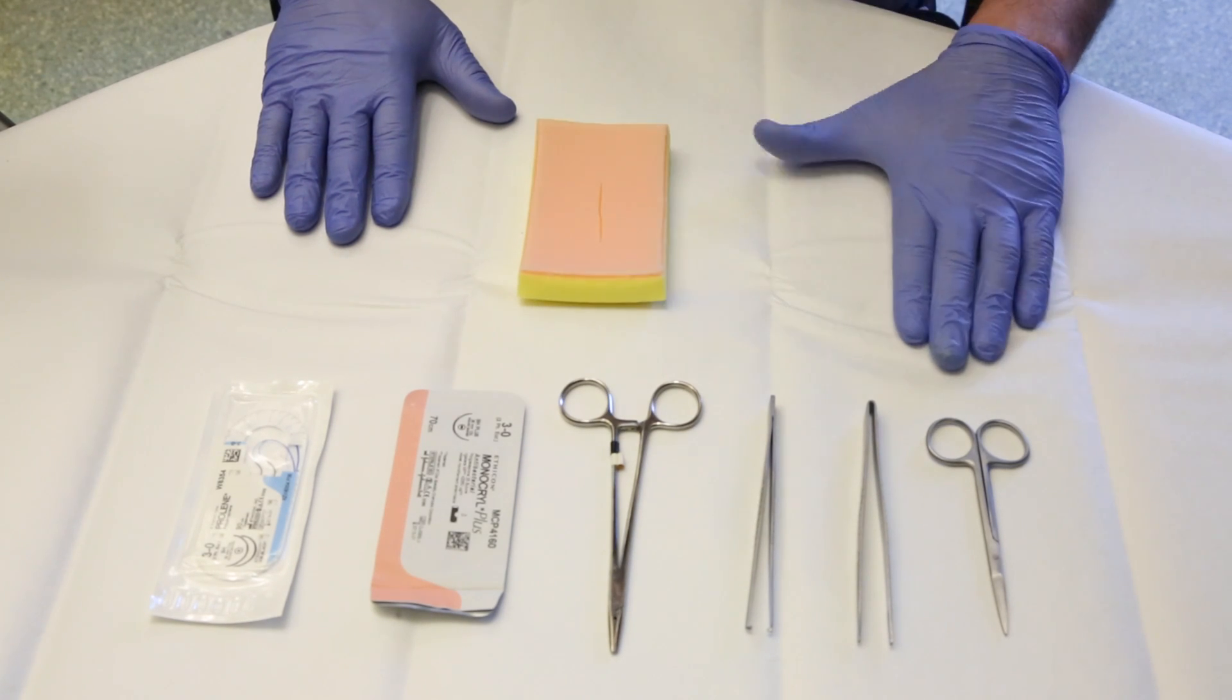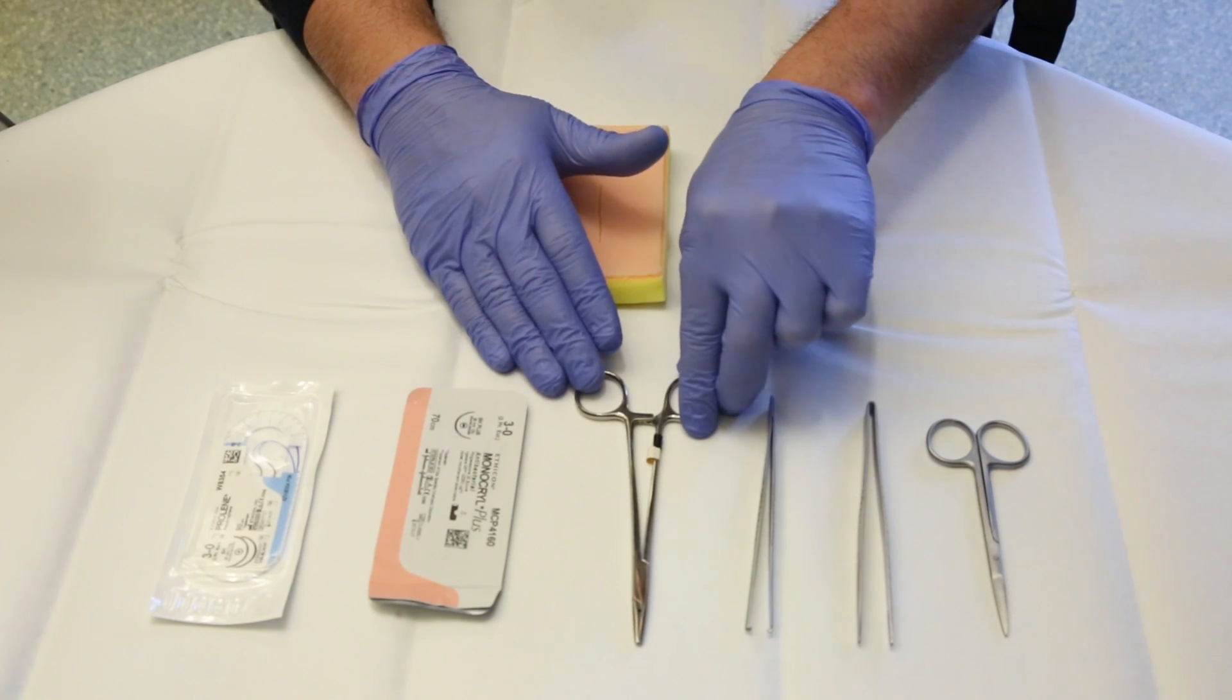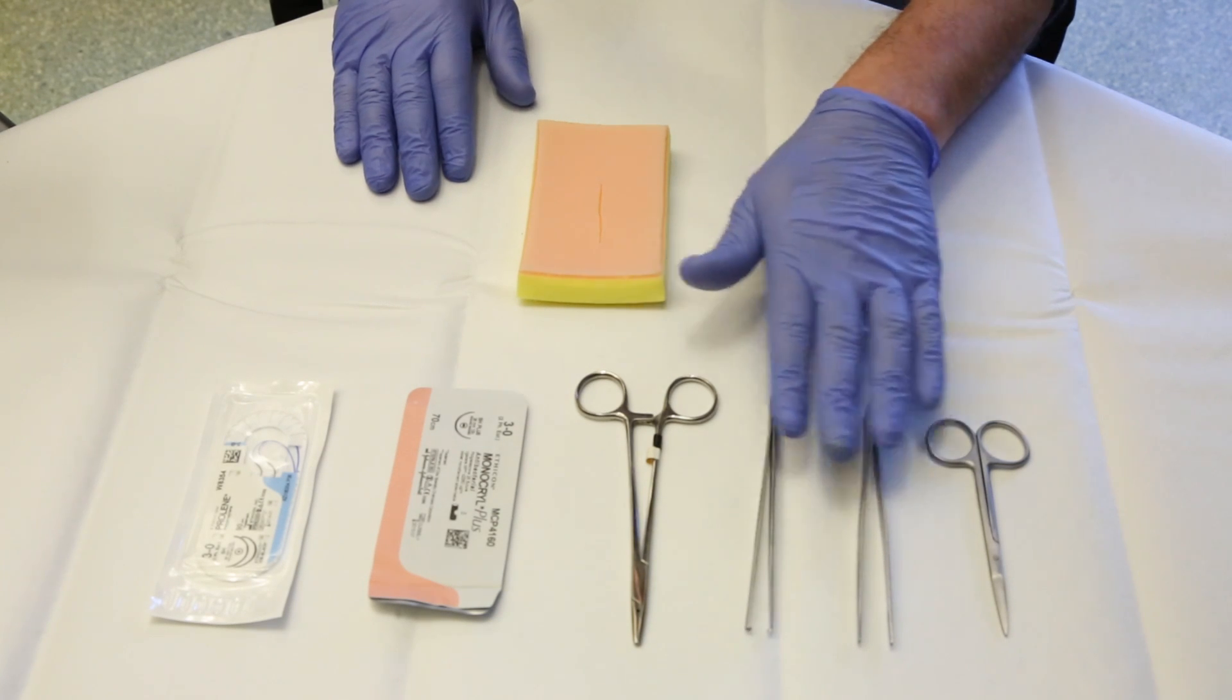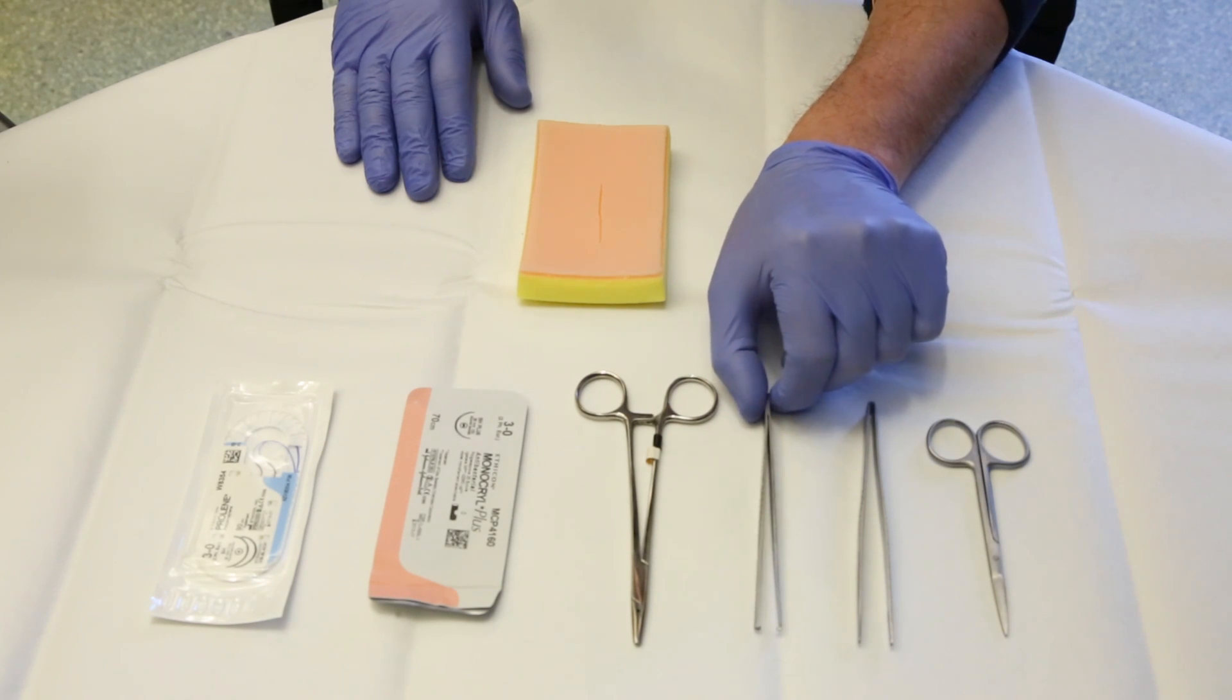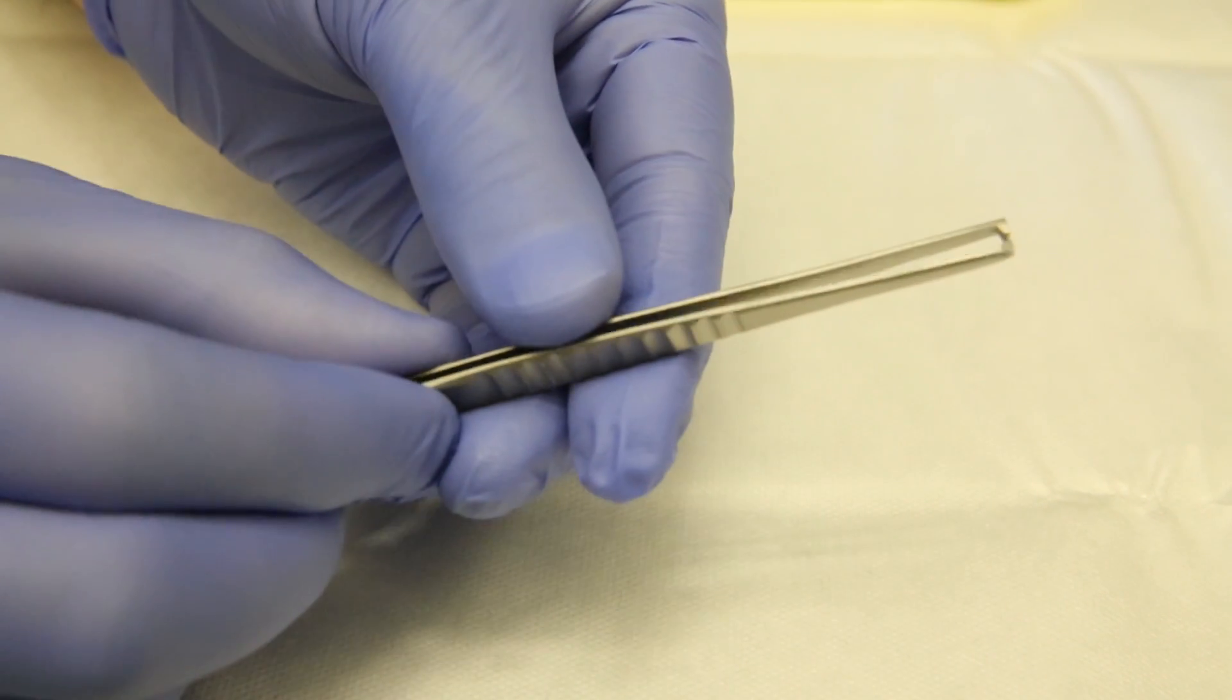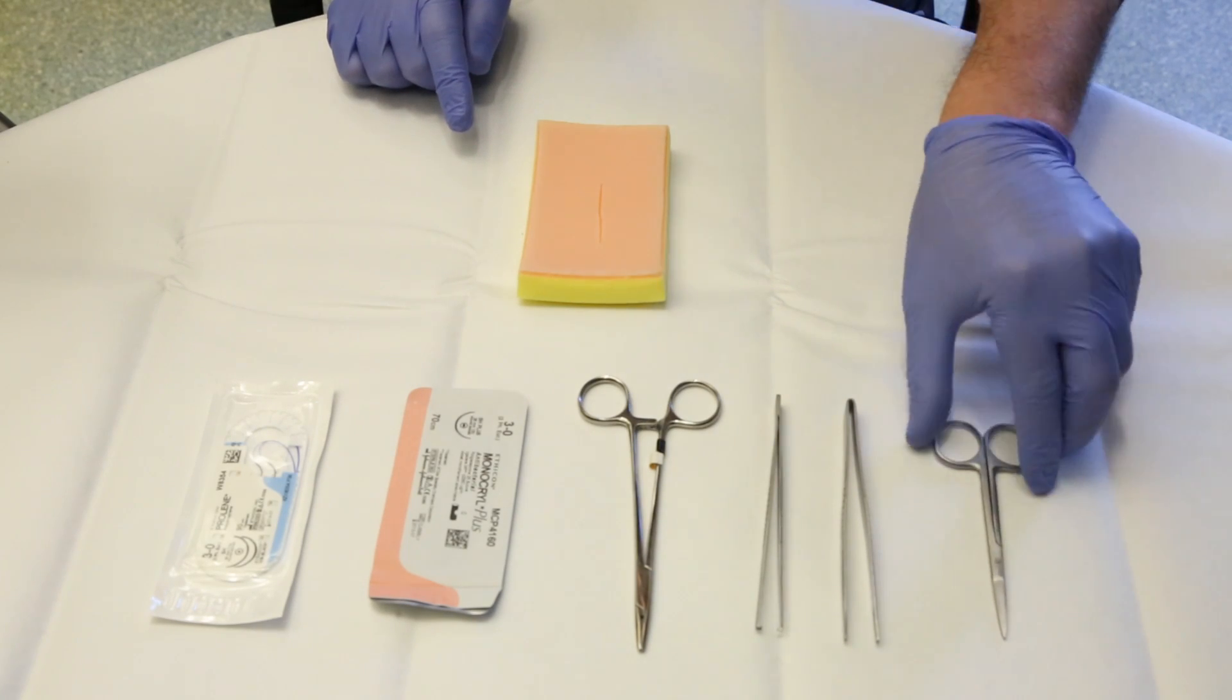So a needle holder or a needle director, forceps. These are tissue forceps to help in stitching but also can give assistance to the direction of the needle. It can be toothed forceps as you see here or smooth forceps. And the last is scissors.